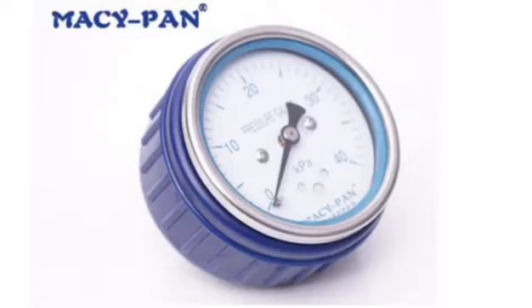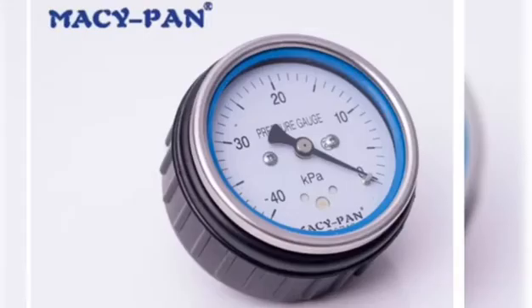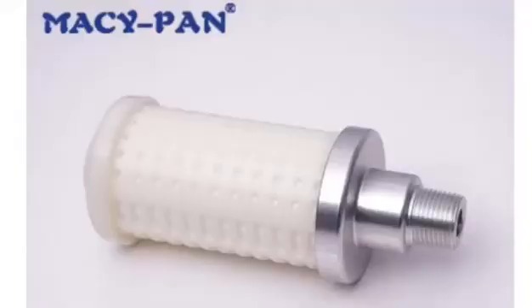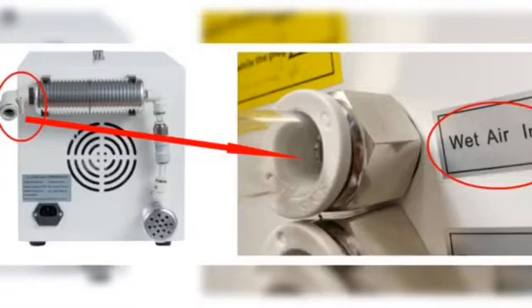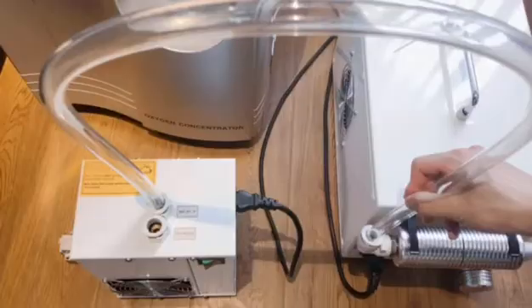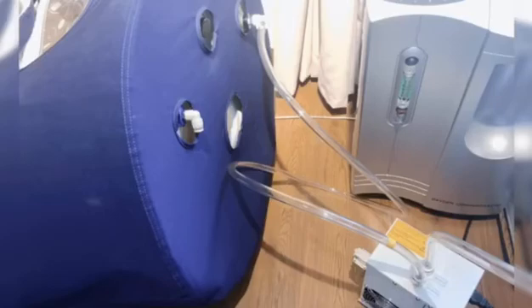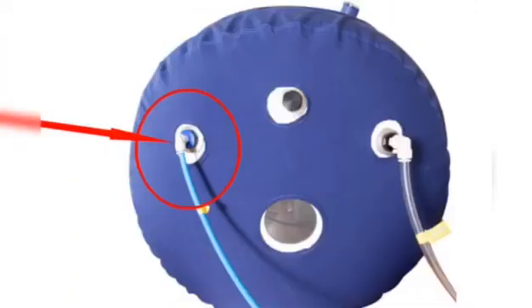Connect the blue pressure gauge outside the chamber. Connect the black pressure gauge inside the chamber. Connect the silencer inside the chamber. Connect the two air tubes between the air compressor and air cooler, and one between the air cooler and the chamber. Connect the blue oxygen tube between the oxygen concentrator and the chamber.